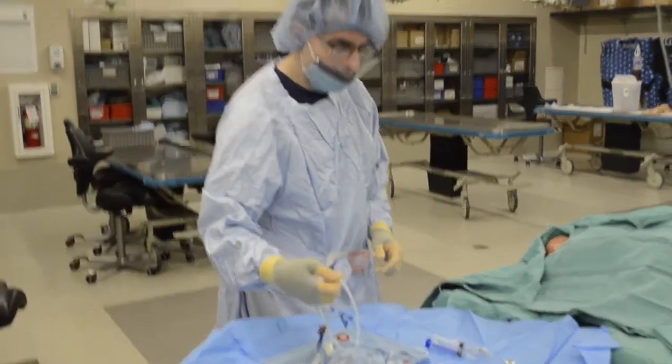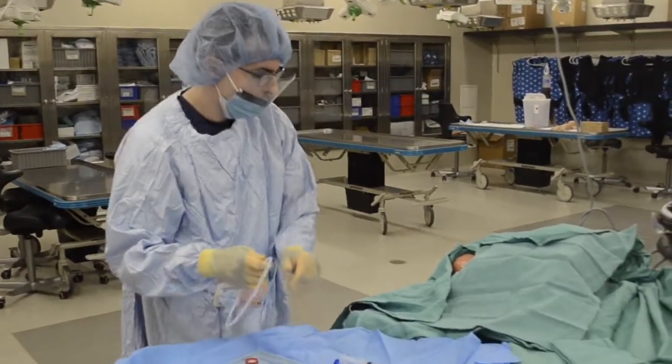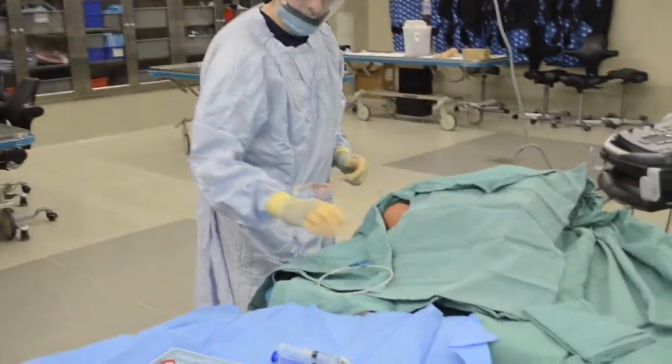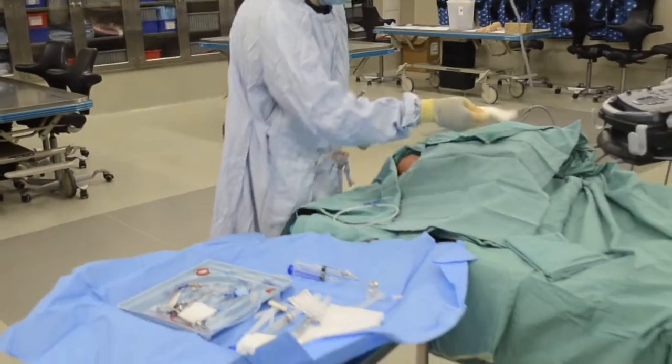I want to make sure that when I put this wire down, it's easy to get, within arm's reach. So I usually just put it right here. I like to put a little extra gauze within arm's reach as well.